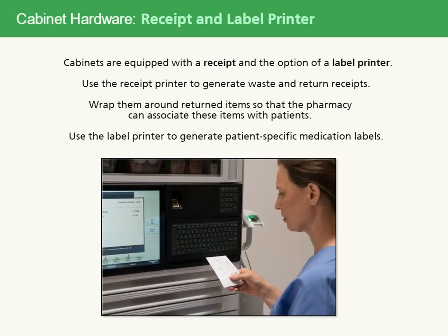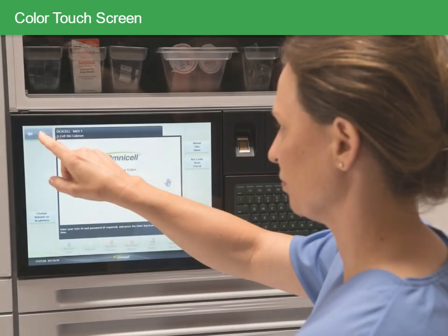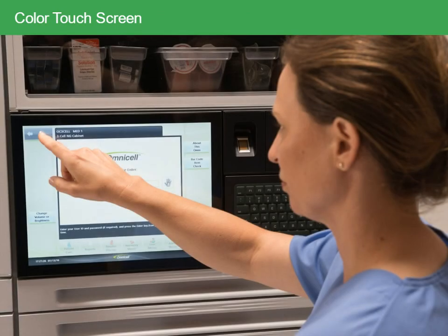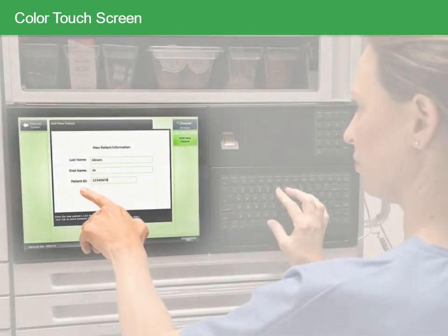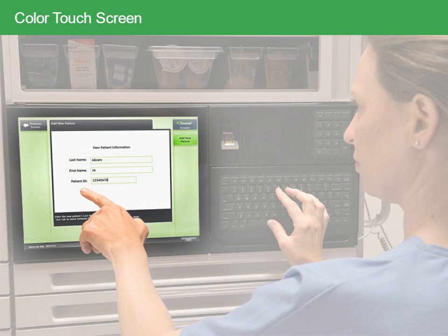Cabinets are equipped with a receipt printer and the option of a label printer. Use the receipt printer to generate waste and return receipts. Wrap them around returned items so that the pharmacy can associate these items with patients. Use the label printer to generate patient-specific medication labels. You'll interact with cabinets using the color touch screen. While there is a keyboard, you can accomplish most tasks by interacting with the screen.